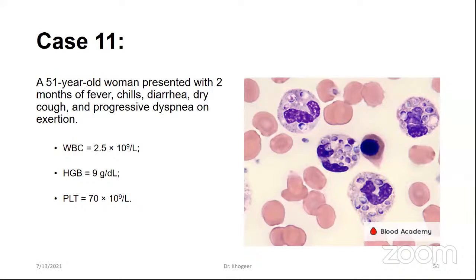Okay, next question. Yeah, this is a good question. Why are there white blood cell qualitative and quantitative abnormalities in the COVID patient? So COVID patients usually present with severe lymphopenia, and the morphology of the lymphocytes in the COVID patient is really atypical and shows a very abnormal morphology, but not at the level of a blast.